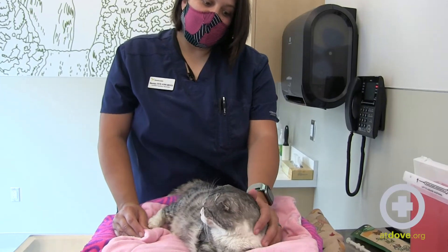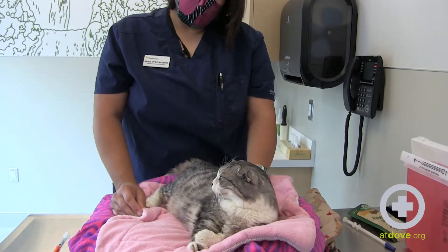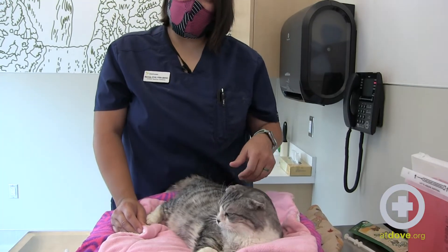Hi, my name is Sarah and I'm a technician at Dove Lewis, and I'm going to teach you how to administer insulin injections to your cat. Diabetes is a really common diagnosis in older cats and it requires daily injections at home. These injections are really important to give consistently and per the recommendations of your veterinarian.